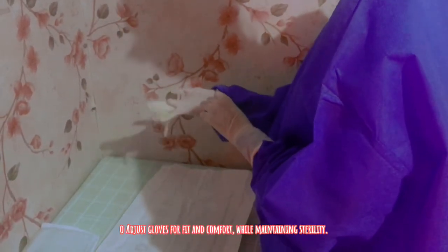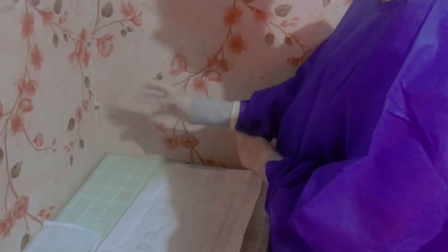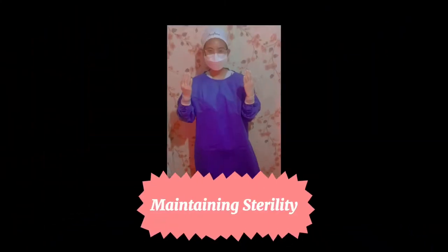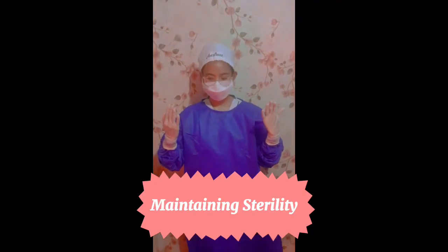Adjusting the gloves for fit and comfort allows the healthcare provider to work with ease. Maintaining sterility allows for prevention of transmission of microorganisms and infection.